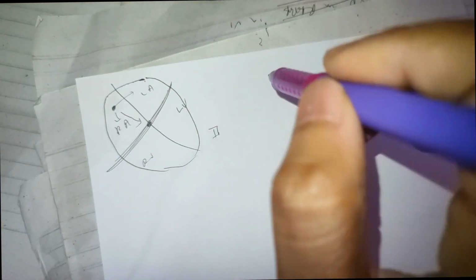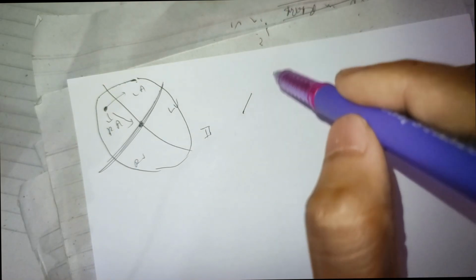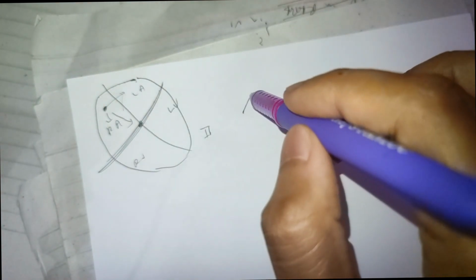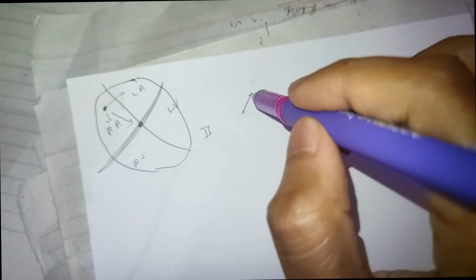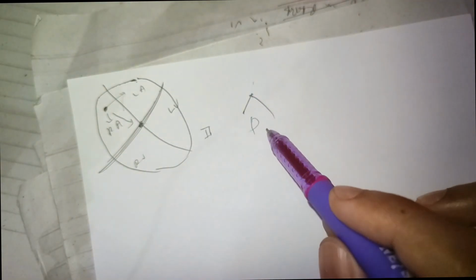So let's assume this is an ink pen, right? And that is in the ECG machine. So when the current is flowing in this direction, in lead 2 it deflects just like this, it is not like this, right? Now the current does not only flow in this direction, it also flows in this direction, because every part needs to be depolarized. So in lead 2 you will not get only this vector. The ink pen again deflects like this, right? So this makes a P wave, right?